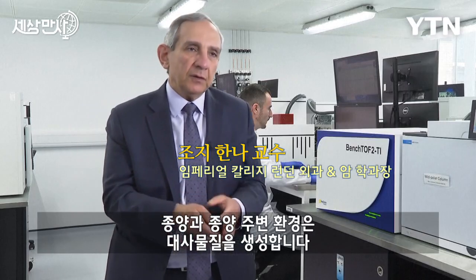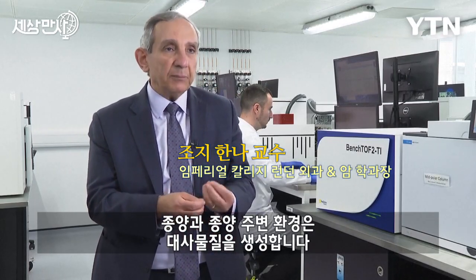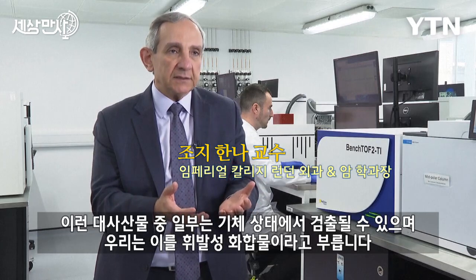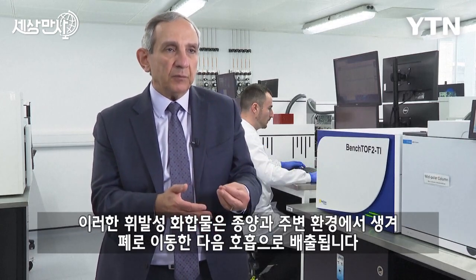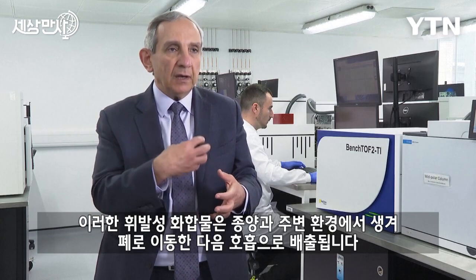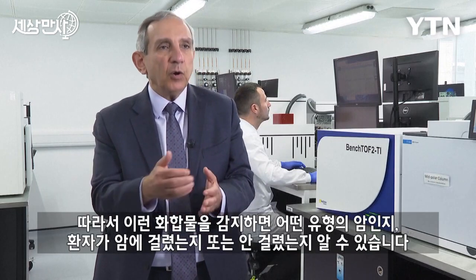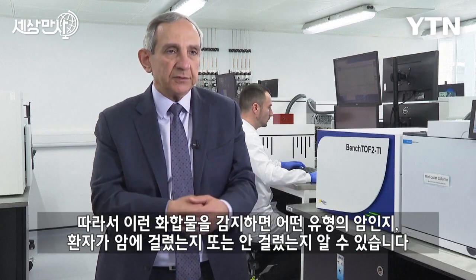The tumor and the environment around the tumor produce metabolites. Some of those metabolites can be detected in the gas phase, and we call them volatile compounds. So those volatile compounds come from the tumor and the environment and go to the lung and then come in the breath. So detecting those compounds gives indication, hope, what type of cancer and whether the patient has cancer or no cancer.